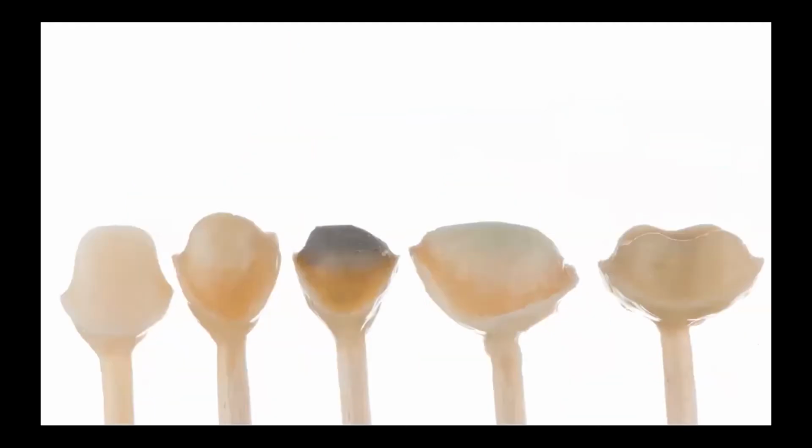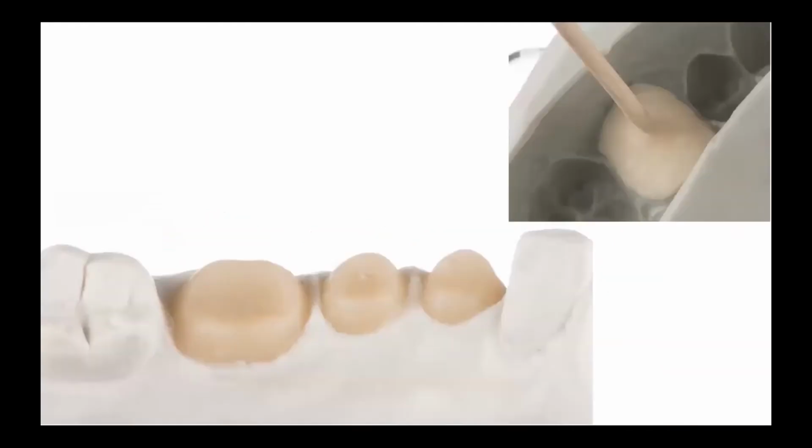And I like this technique because I have an unlimited opportunity to modify every segment of the prepared tooth. For example, to mimic a metal post, or to mimic the enamel area, or to mimic some chromaticity or some discoloration. And after that, at the time of making the restoration, I can take into account all these things. And this way, I avoid the chance of aesthetic damage to my restoration.